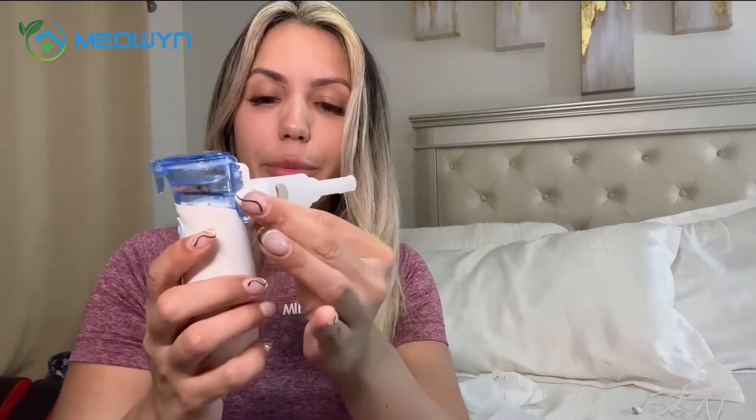Once you have your nebulizer set up, you're going to be able to use it by just turning on this blue button here. As you can see, the steam starts coming out and you're ready to use it.